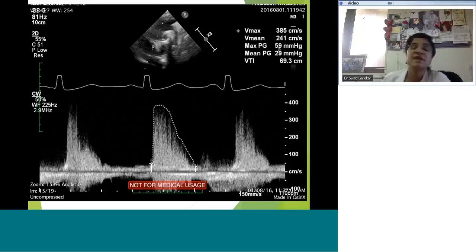20 is the cutoff now. Earlier it used to be 25 to differentiate between mild and moderate. And where is 25 and where is 29? And what is to say that if I take this 10 times I'll get a different number, maybe I'll get a 25 as well. And I can debate with you and say, oh well, this is actually an overestimation.